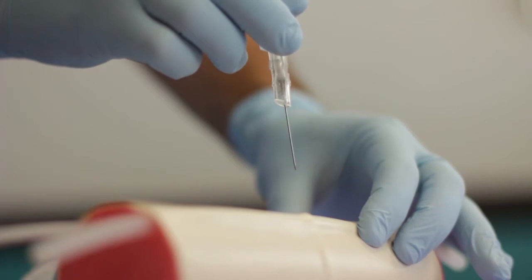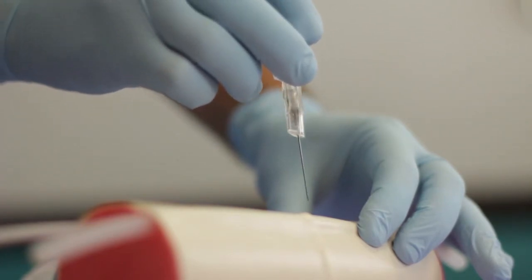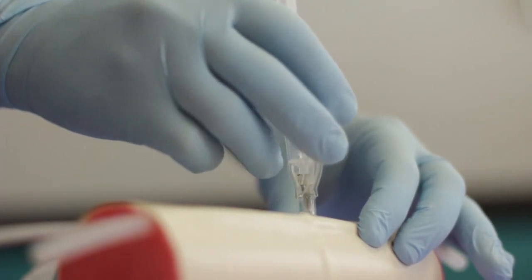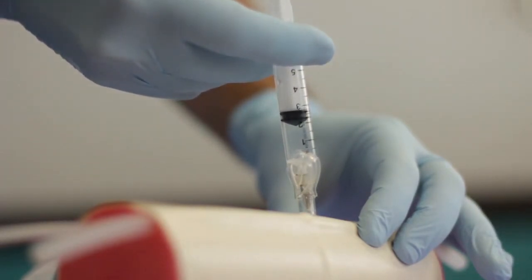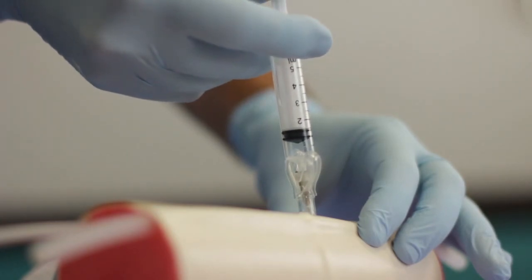Perform a simulated intramuscular injection by injecting the Venipuncture trainer. Penetrate the skin at 90 degrees and insert the needle up to the level of the safety device. Inject the 3-5 milliliter air into the Venipuncture trainer.